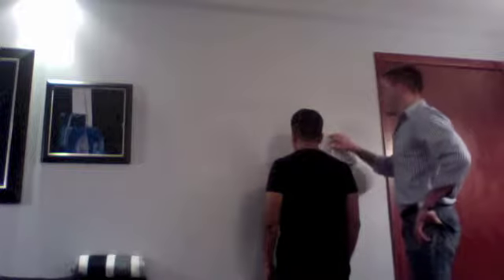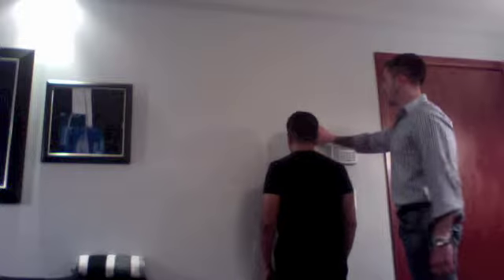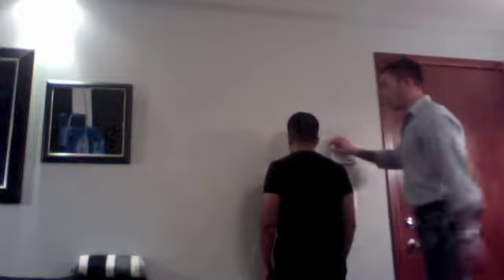And then you want to move the bottom one, 50 to 150. Then you want to move the top one, which is single pounds, and then you want to move that until the line is parallel on the side. Alright, so it's parallel, so you ask the patient to step off.